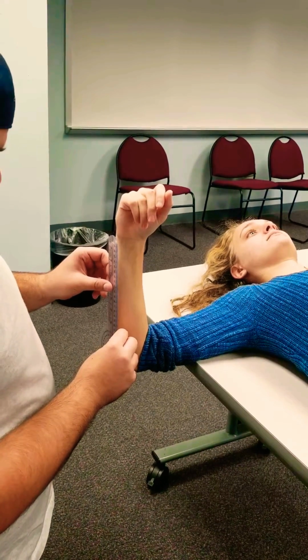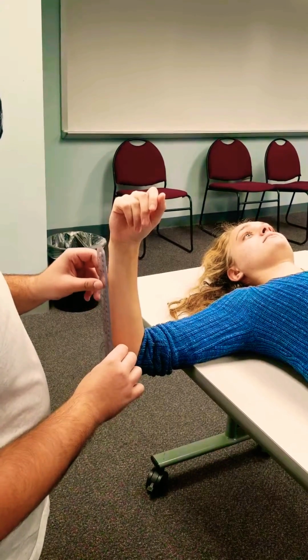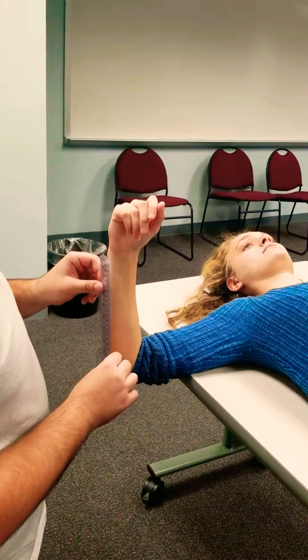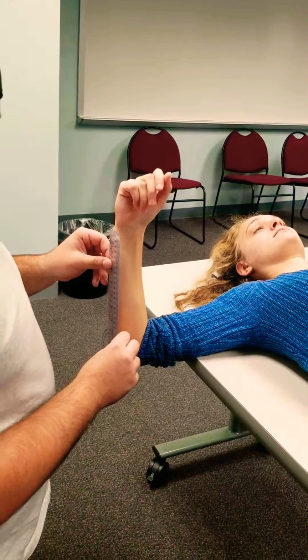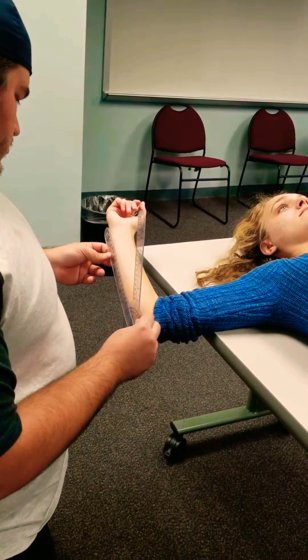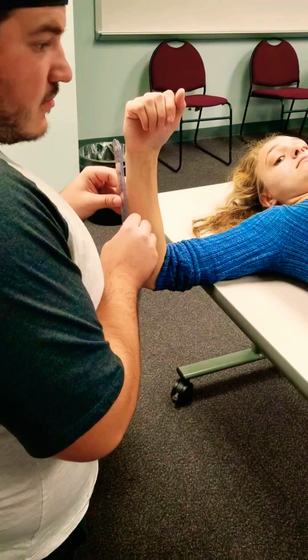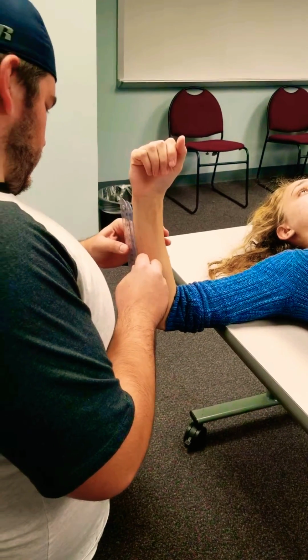The landmarks that we are going to use for the center is the olecranon process. The stationary arm will be perpendicular to the floor, and the movement arm will align with the ulna and use the ulnar styloid process as a reference point. The first range of motion that we're going to study is active. The next range of motion that we're going to do is passive external rotation.